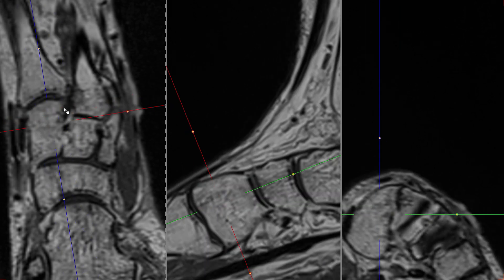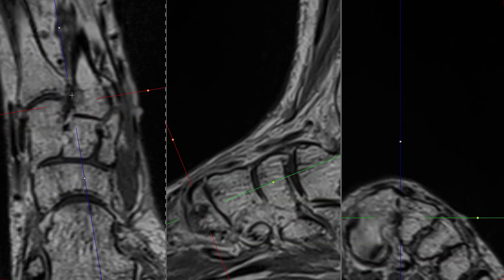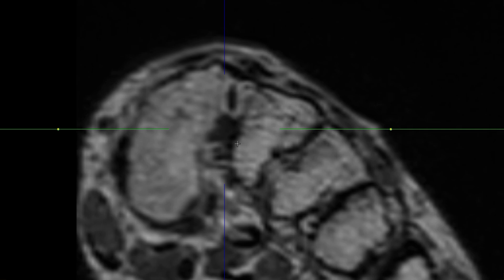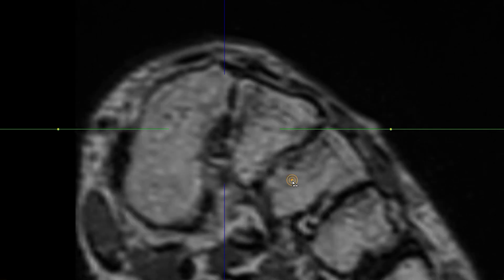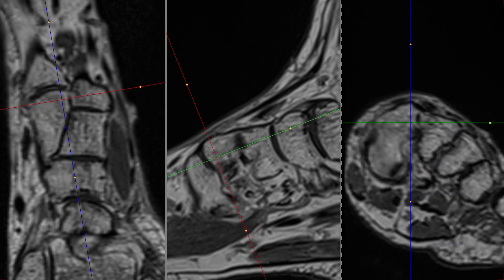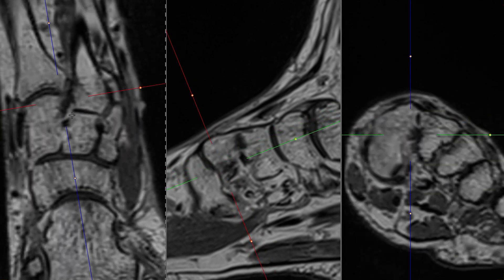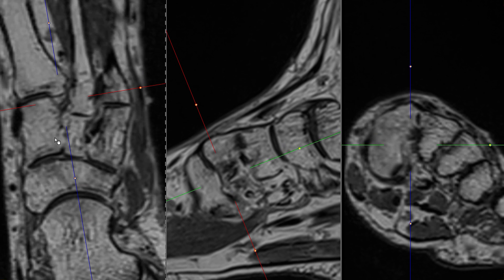Going more plantarly, we are in the region between the bones — the medial cuneiform and the base of the second metatarsal. You can see this strong black structure, which is the interosseous component of the Lisfranc ligament complex. It's very nicely visible on the axials as you scroll through, and you can see there is more than one fascicle between these bones in the interosseous part, also well seen on the coronals.